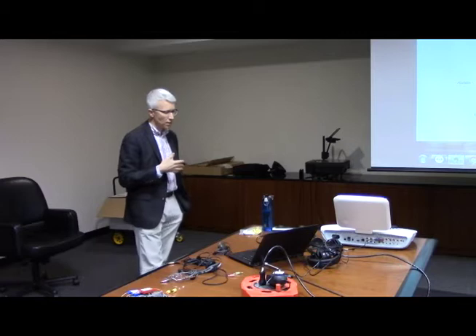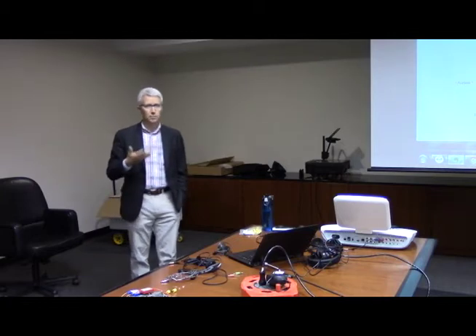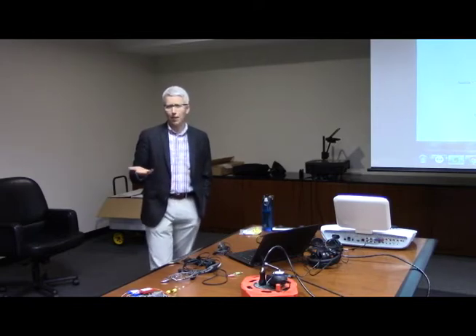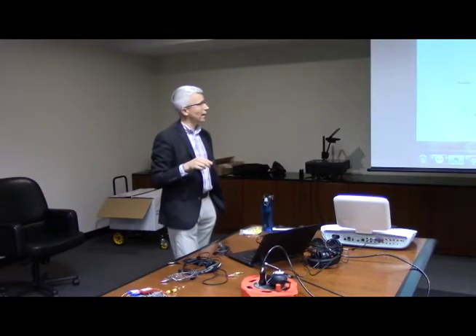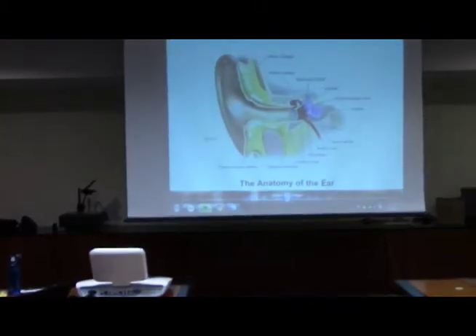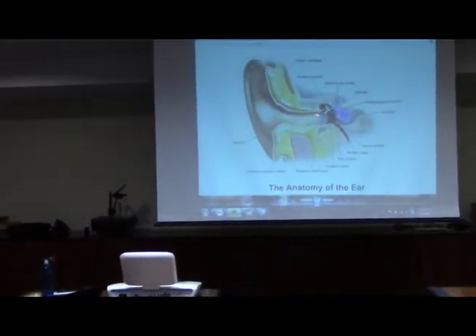I want to start off with a little bit, and this is going to be very basic, but just how we hear. To give you a little bit of background, so as I'm talking about different things, if somebody says something about a bone oscillator, you understand how that has anything to do with hearing whatsoever. So I'm just starting off with the ear. This part here should look pretty familiar to everybody. This serves to collect the sound. This is your outer ear. This is your ear canal right here.